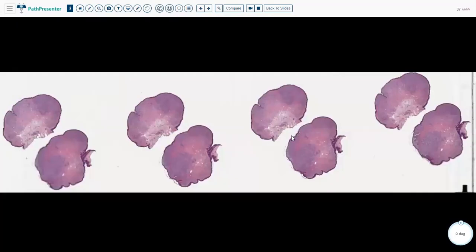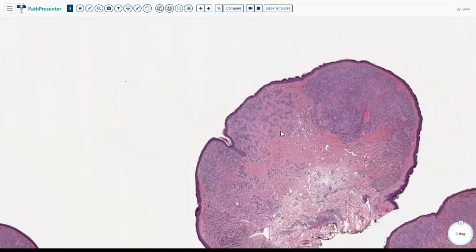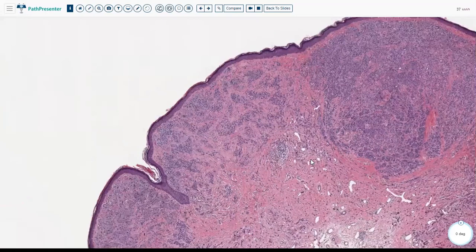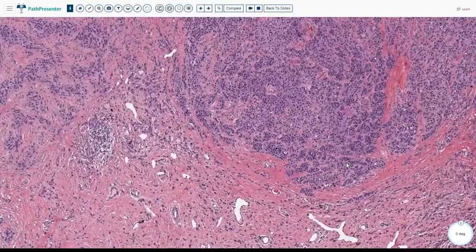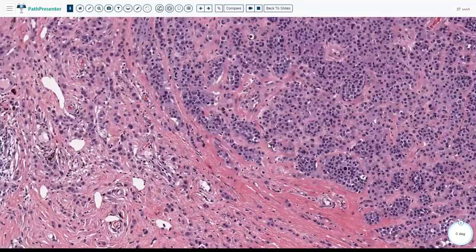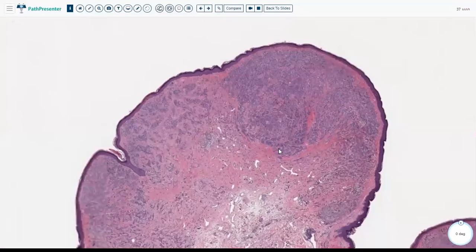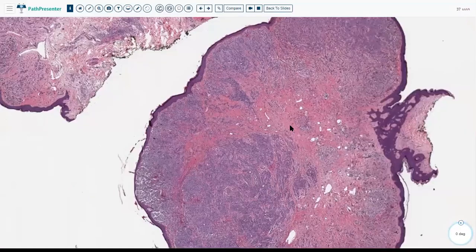Moving on very quickly. I don't want to confuse you. I just want to scare you a little bit. What you would think is a nevus is actually a nevoid melanoma. A feature here, just very quickly, see the nests go all the way deep, very uniform cells, a few mitotic figures, and history of melanoma is very important. I'm using this example just to tell you that history is very important, and in melanoma, metastasis can look very much like a nevus.